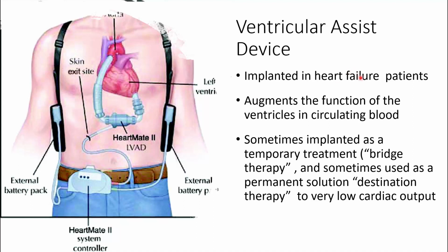As I said, it's implanted in heart failure patients. This is open heart surgery. This is a significant surgery. It can only be done at major medical centers, although I have heard that here in Idaho, we may be getting a center in the next 5 years, in which case you'll see even more of these patients. It augments the function of blood flow, and it's usually implemented for two goals.